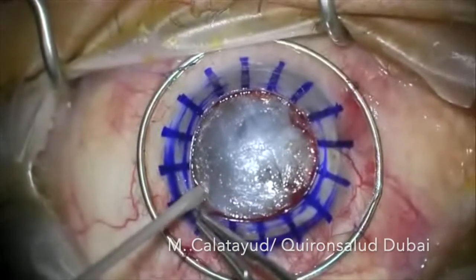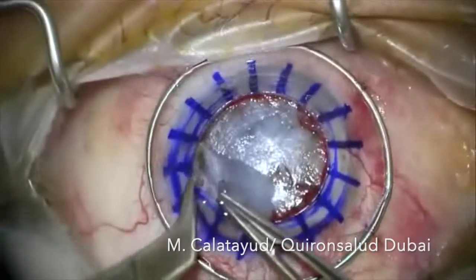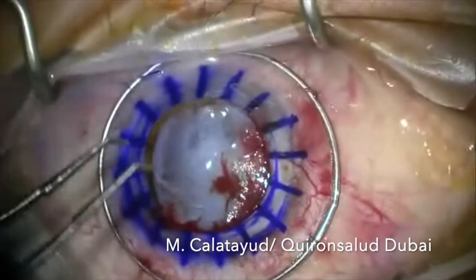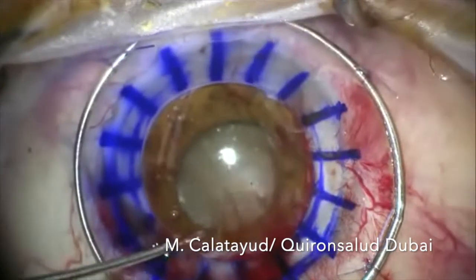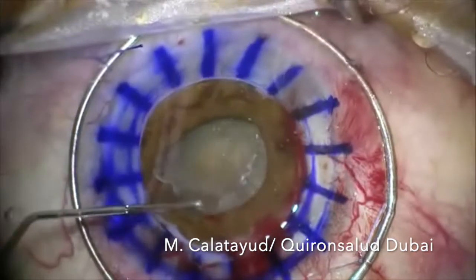We are going to remove the deep stroma and the Descemet's membrane, and then we will cut this thin lamella. When we reach the anterior chamber, we are going to do a can-opener capsulotomy with a cystotome.